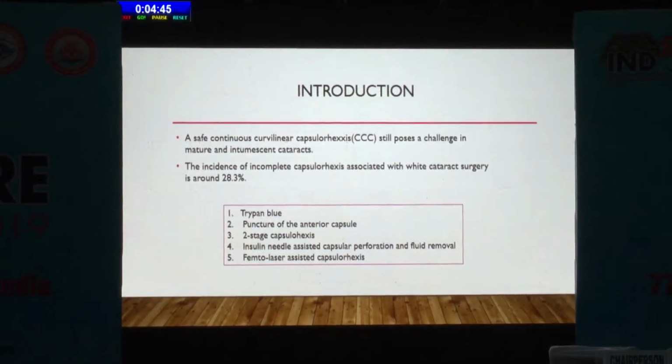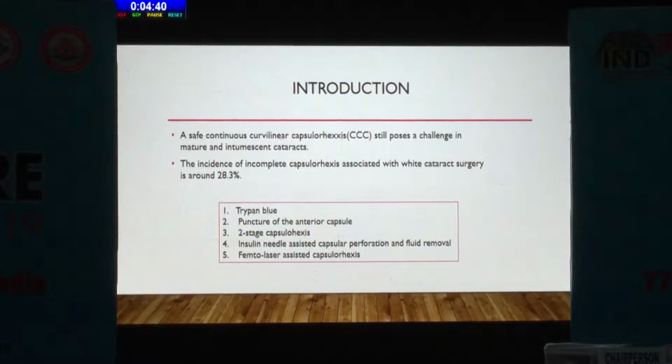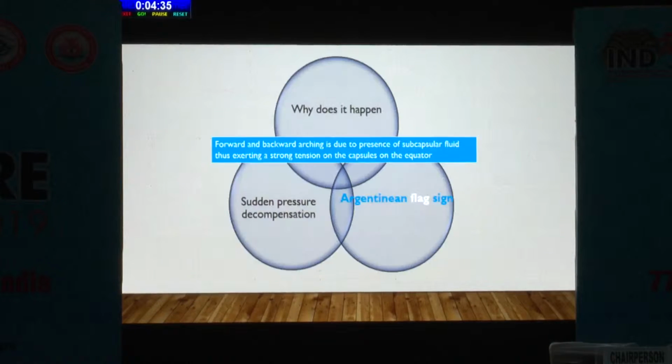We have trypan blue dye. We can puncture the anterior capsule, or we can do a two-stage capsulorhexis. We can do insulin needle-assisted capsule perforation and fluid removal, and we have again the femtolaser capsulorhexis.